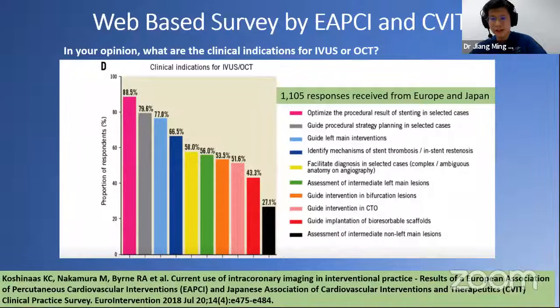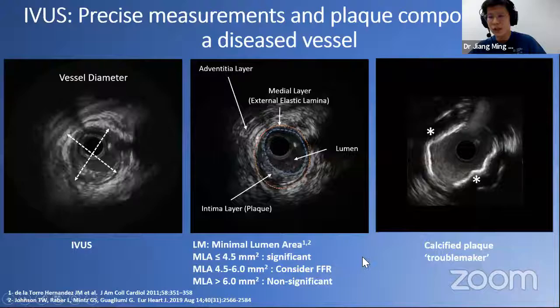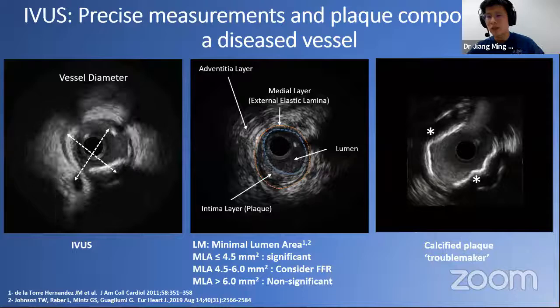And this has actually been translated into clinical practice in some form. Here, we have a slide that shows the results of an internet-based survey conducted among European and Japanese interventionists. Among 1,100 responses, the survey looked at IVUS use to guide left main interventions, assess intermediate left main lesions, and guide intervention in bifurcations, and found some of the common indications. As you can see here, IVUS allows operators to obtain precise wall measurements and to understand the underlying plaque composition of a diseased vessel, some features which may not be so readily apparent on plain angiography.